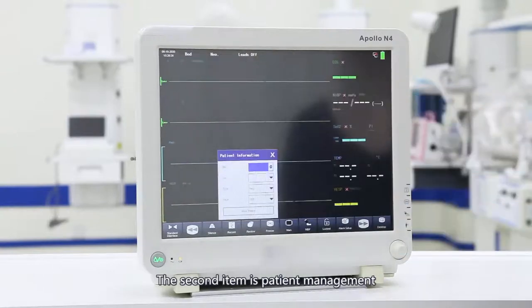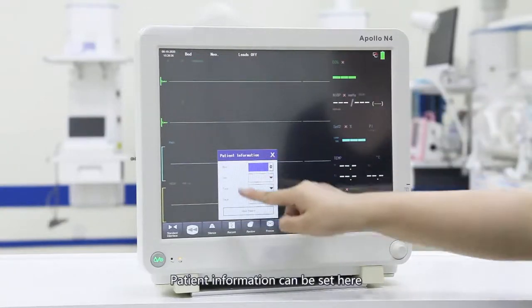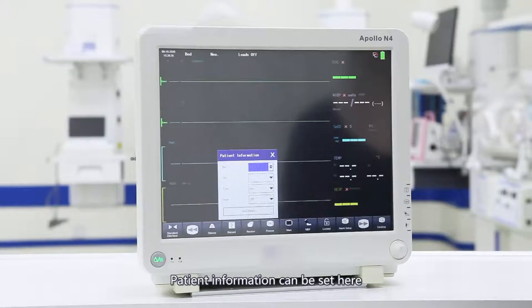The second item is patient management. Patient information can be set here. The default alarm limits for adults, children, or newborns are different in different modes. You can choose whether the patient analysis function is turned on or off, and you can create a new patient, clearing the existing data to create a new patient record.